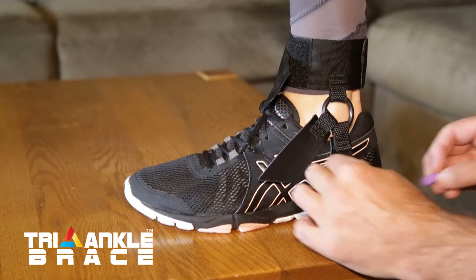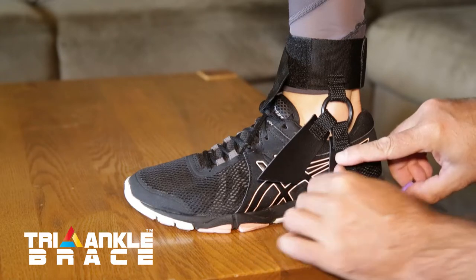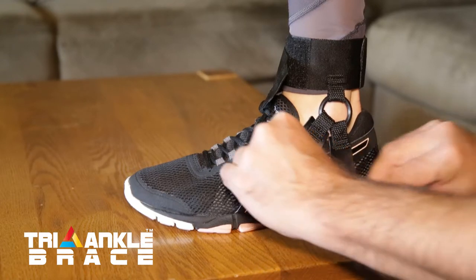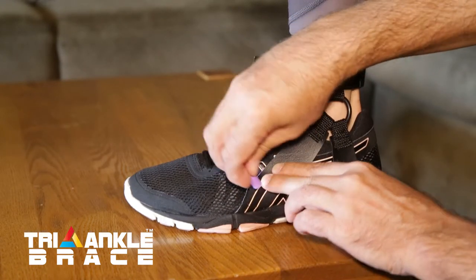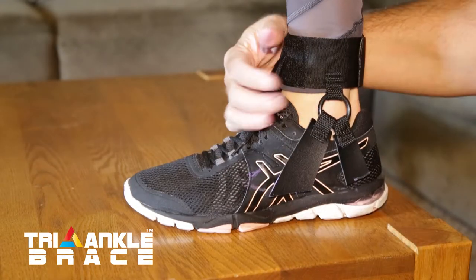You're just going to take a little bit of chalk and mark it — mark the back side, mark the bottom. The second one is going to touch it here and that arrow is going to point forward. Take it off and attach it to the shoe.